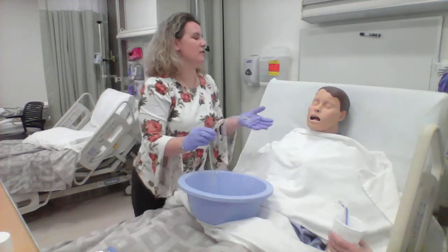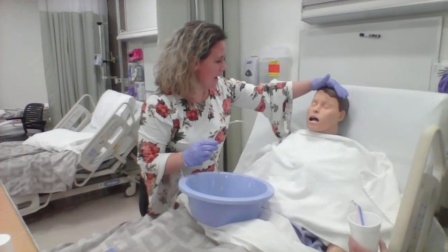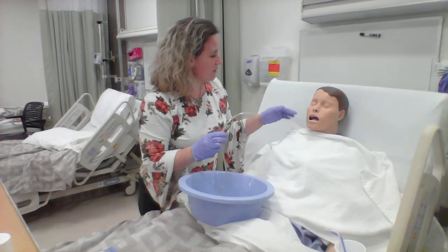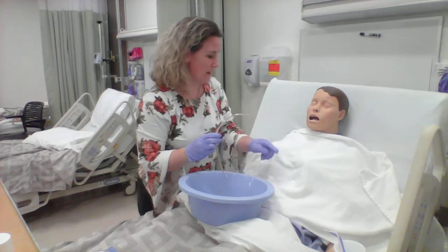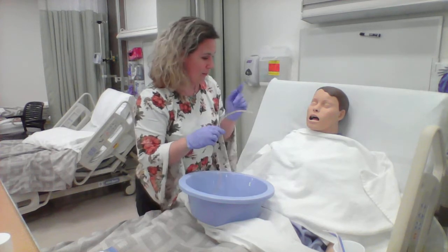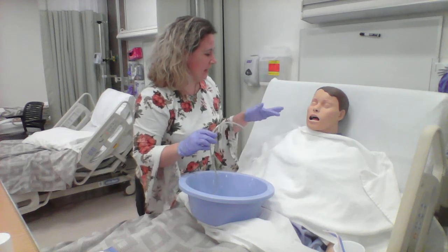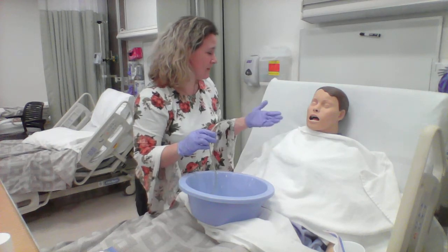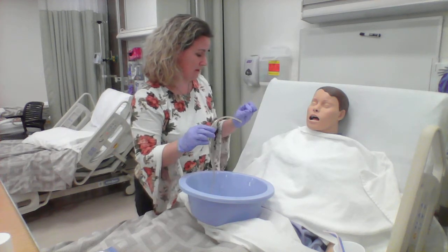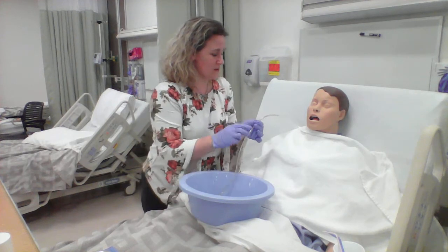So I'm just going to have you keep your head normal, and then as soon as we insert it into your nose and we get to a place in your throat, I'm going to have you drink water and tilt your head forward and swallow, and that will help this go down a little bit easier. It's going to be uncomfortable, but if you feel like you're coughing and it's hard to breathe, then we'll go ahead and stop, and I'll pull it back. Okay, so are you ready?